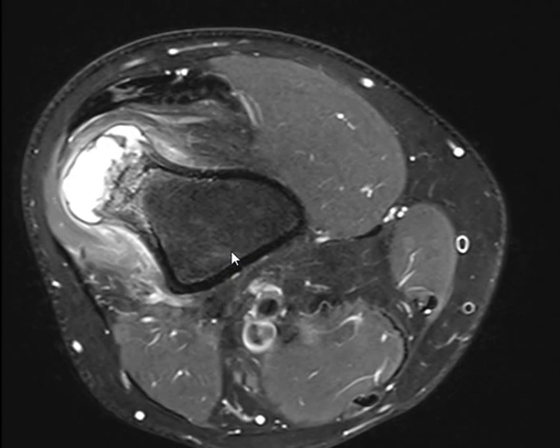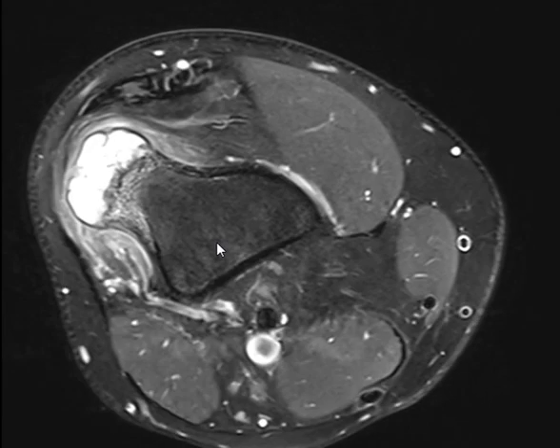So what should I do in this case? First search for whether it is multiple osteochondromas. Okay, we can look for other osteochondromas or exostosis, and compare with the previous. Compare with the previous, excellent. And the patient is in the machine now. What should I do? Give contrast. Show us the contrast.